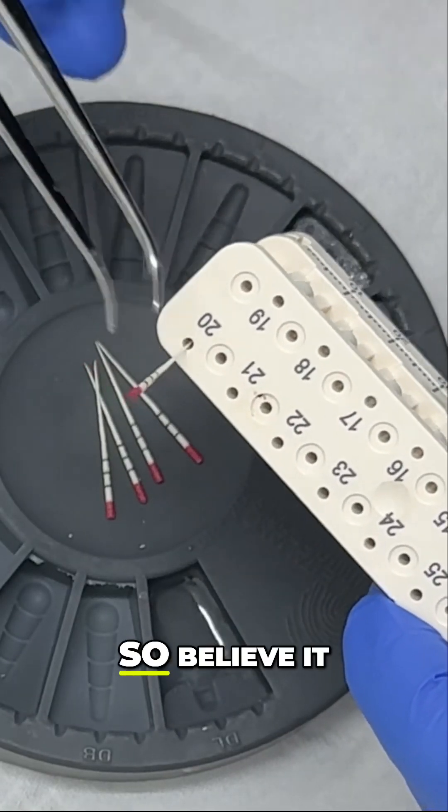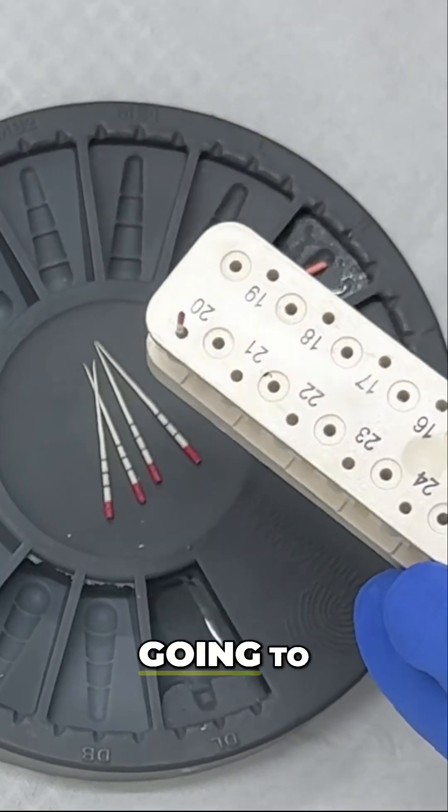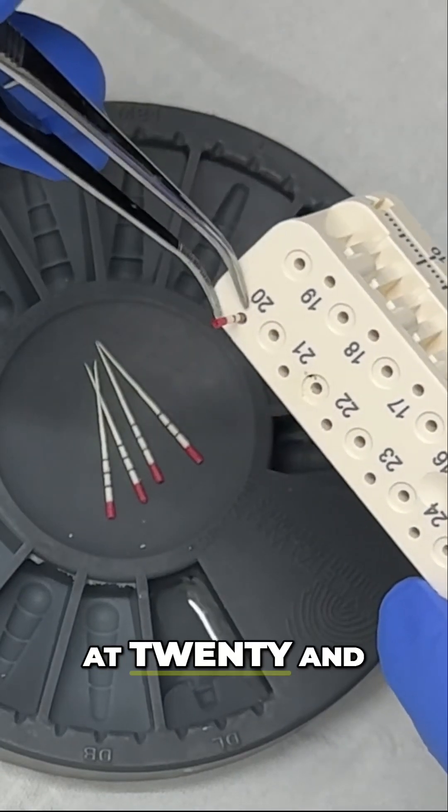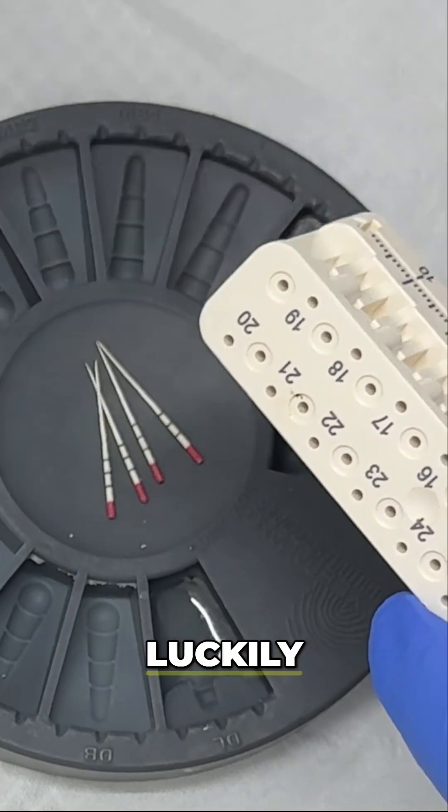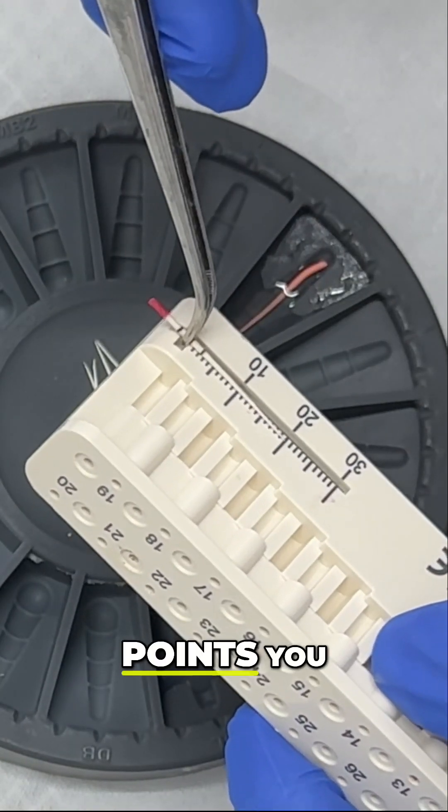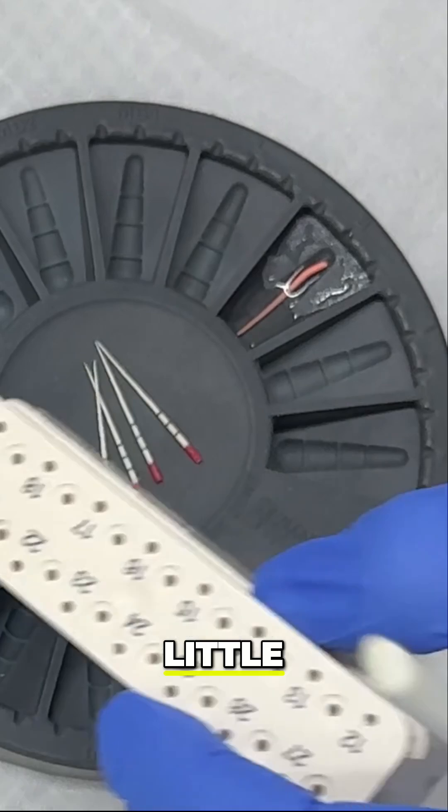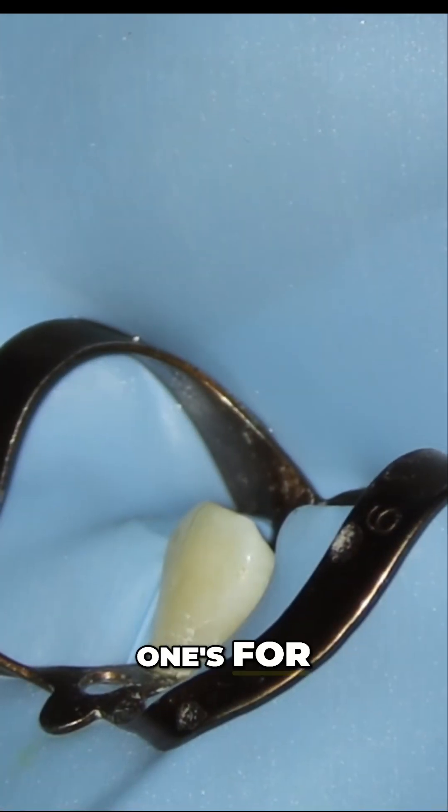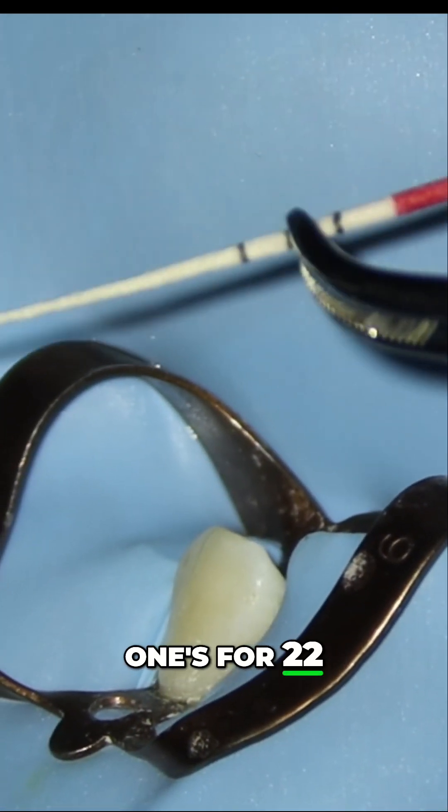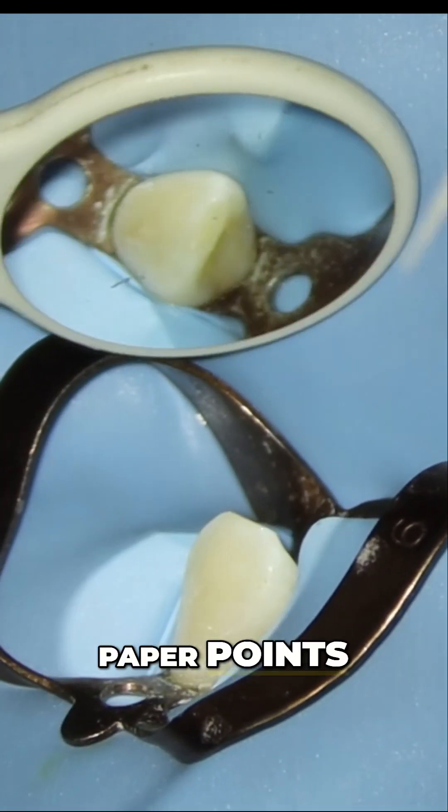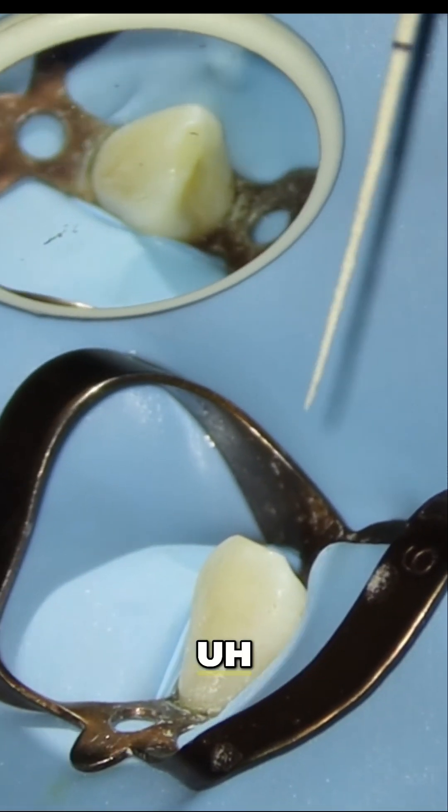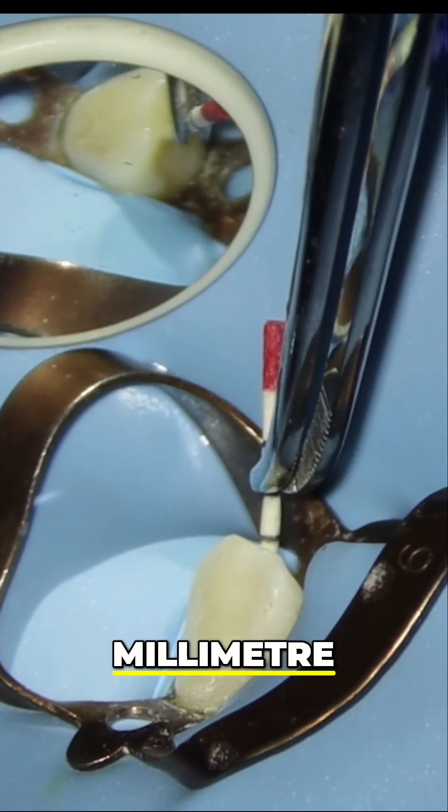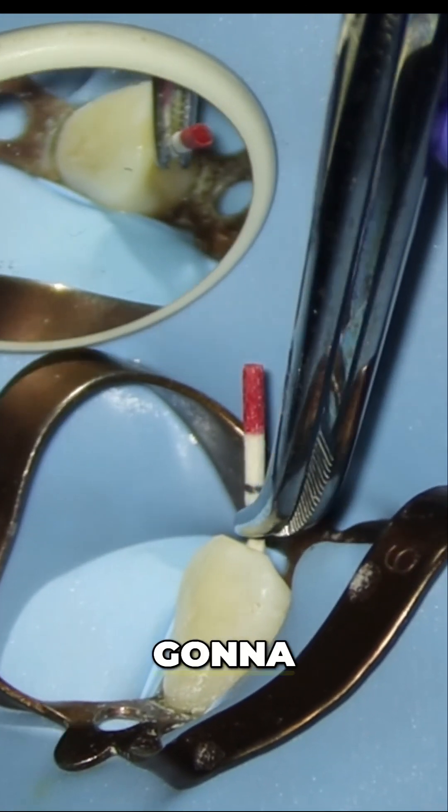Believe it or not, we're going to measure these paper points at 20. Luckily, on the side of these paper points you can see little black marks—one's for 18, one's for 20, and one's for 22. I'm going to push these paper points at this 20 millimeter length, so I'm not going to push these through.